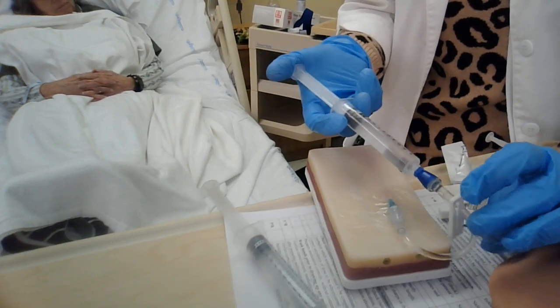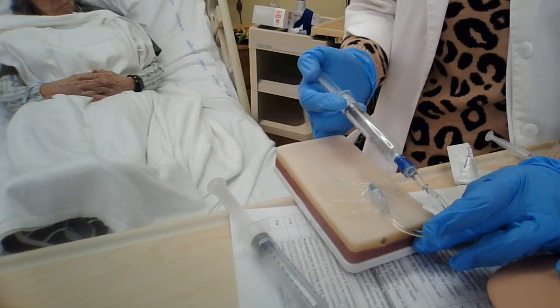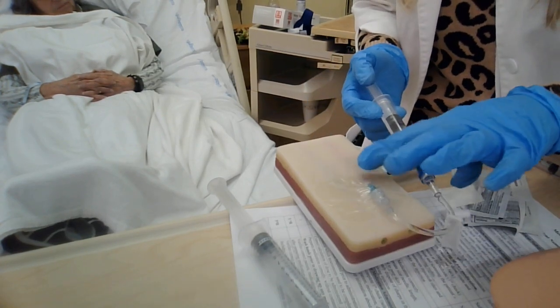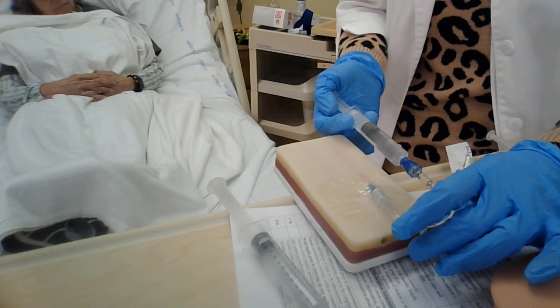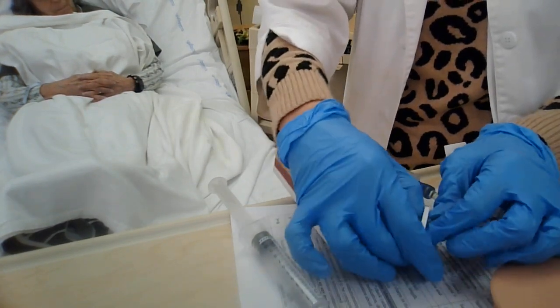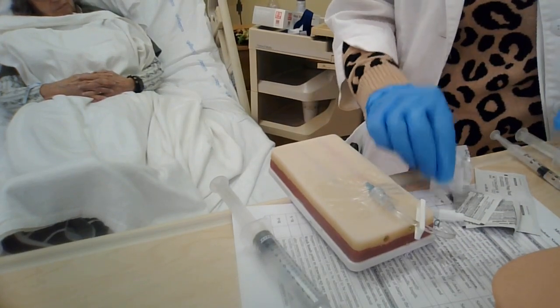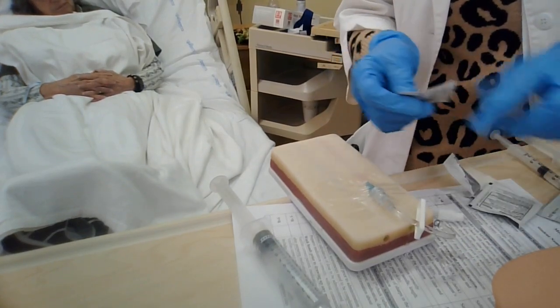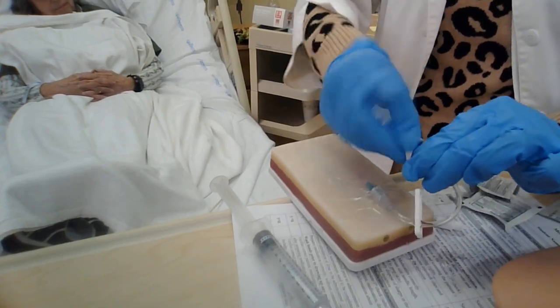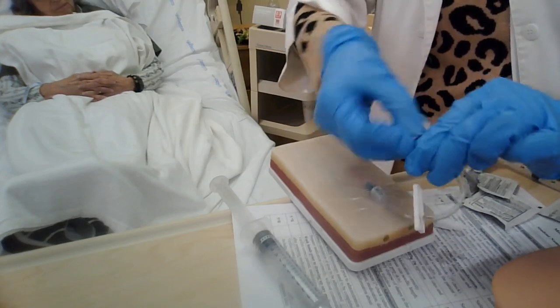So I go ahead and open up the clamp, and I'm going to flush it through. And I'll ask the patient while I'm doing that, are you having any pain? And I'm looking for any leaking, swelling, bleeding. Any pain there? Okay, so now I'm going to go ahead and clamp, and I'm ready to administer my Lasix. So again, we're going to grab a new alcohol swab. We're going to scrub the hub for at least 5 seconds. If it's a central line, you'll do it for at least 10 seconds.